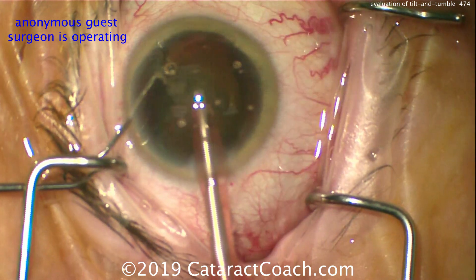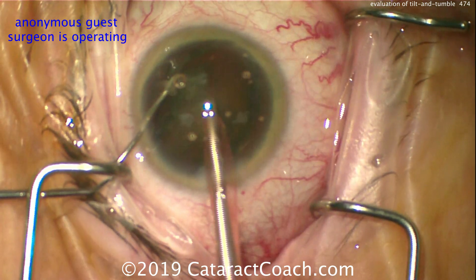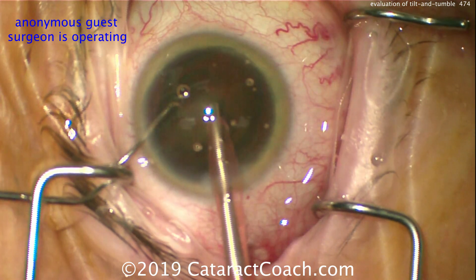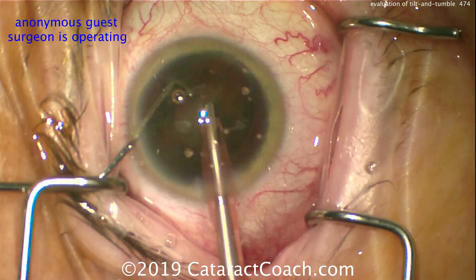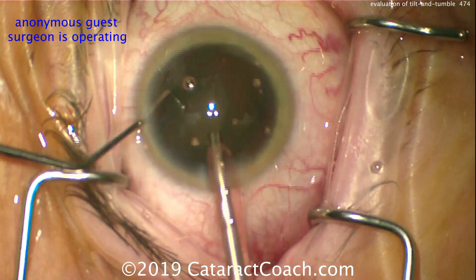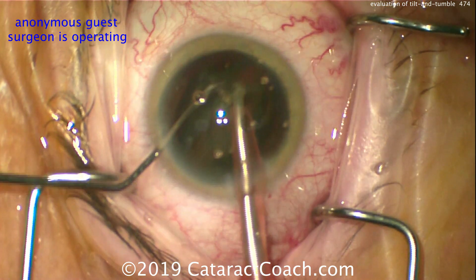The goal here is to keep the nucleus in front of the FACO probe and not underneath it. So even here, I'd recommend pulling back the FACO probe a little bit. Don't operate near the nasal angle of the eye — operate more in the center of the cornea, center of the anterior chamber. Also, look how the chopper keeps hitting the speculum. You need to adjust that — use a different speculum or change the positioning of your instruments. You shouldn't have that chopper throughout the case hitting and rubbing on the speculum. That's not ideal.